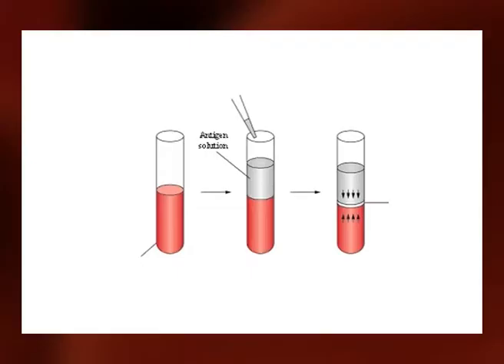The loading of the sample and antibody includes spinning the anti-human antibody in a microfuge and transferring the supernatant into test tubes or capillary tubes, depending on the volumes of the stain and the antiserum extracted. The sample is then placed carefully over the top of the antiserum solution, which is usually denser than the sample. The immunodiffusion reaction is done in the following ways. The reaction is carried out at room temperature. In a positive reaction, a white precipitate between the two layers can be observed after several minutes.